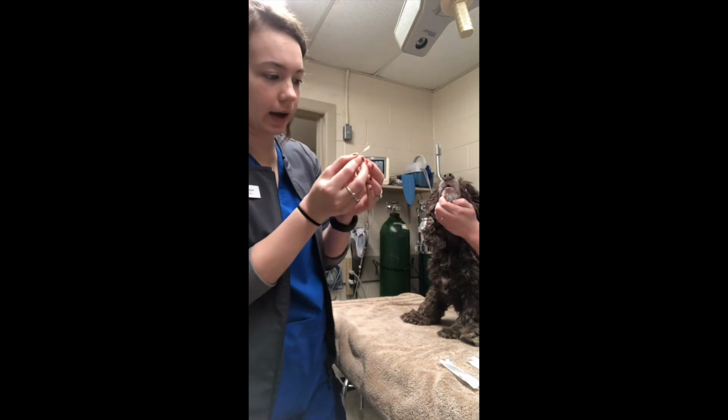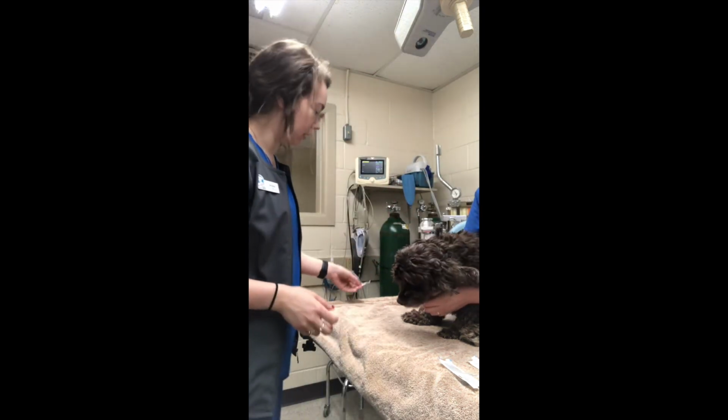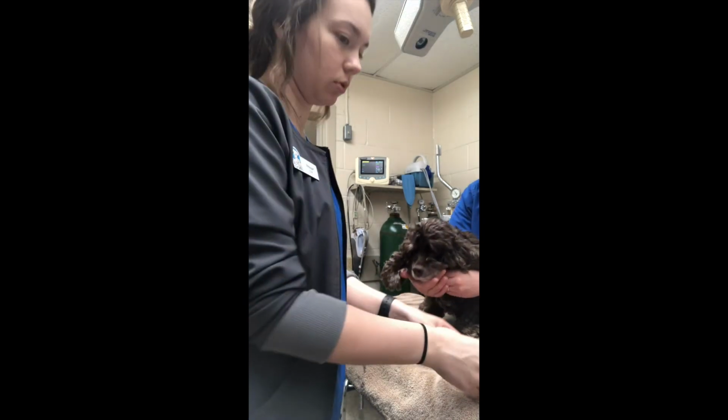Okay, so in her right eye, it's at about 16, so anything greater than 15 is going to be considered normal.